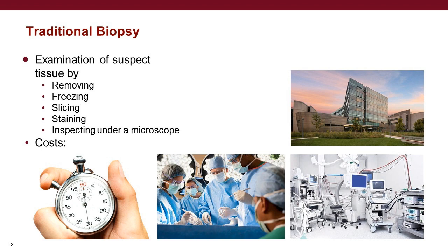So this process has a couple of costs associated with it, one being time. The amount of time it takes to remove the tissue, freeze it, slice it, and stain it usually means that patients need follow-up visits. That also has costs. I mean, there's labor costs associated with that extra time and multiple specialists. So yeah, the next is labor. Usually the person removing the tissue isn't the one freezing it, slicing it, or examining it under a microscope. Another is equipment. Relatively expensive microscopes, staining equipment, and alongside equipment really goes facilities. All this stuff takes a big infrastructure to support it, and it would be easier if it could be done on the spot with a lower cost bedside system.